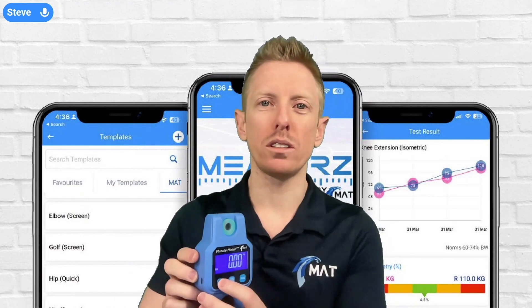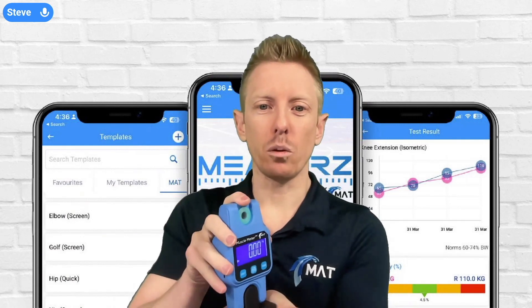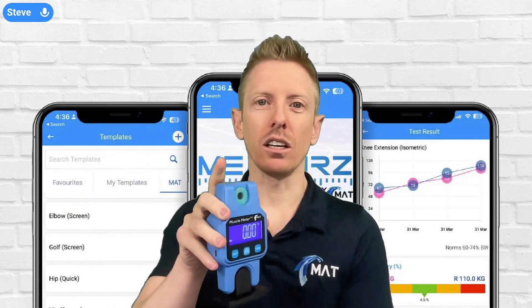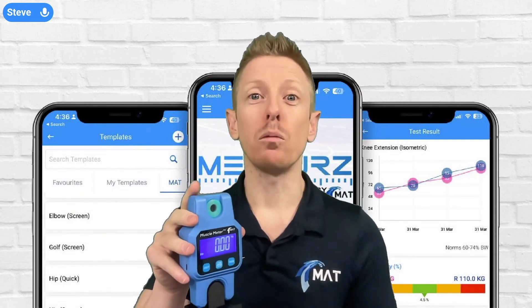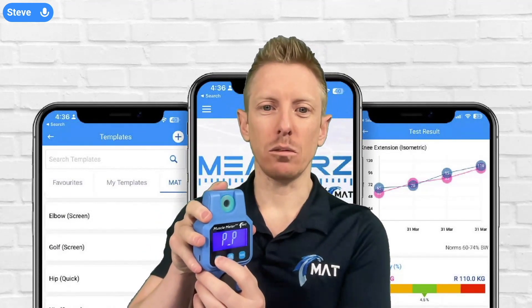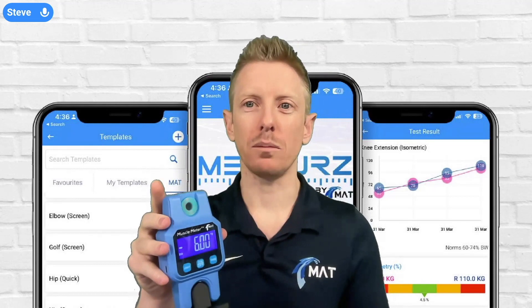There are two modes on the muscle meter. The first is peak force, which you've just seen. The second, if I long-hold the units button, is PL mode, where it will show you the peak force for about one second and then drop back to zero. This is used for a different type of testing and we'll talk more about that with the measures app videos later in the training portal. The ideal mode for most isometric strength testing is PP mode — you apply pressure and it holds the reading.